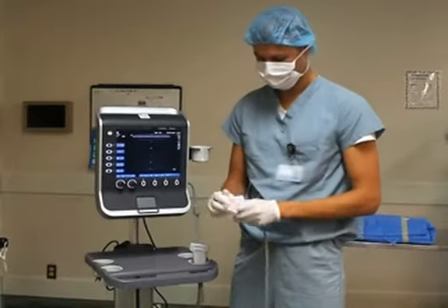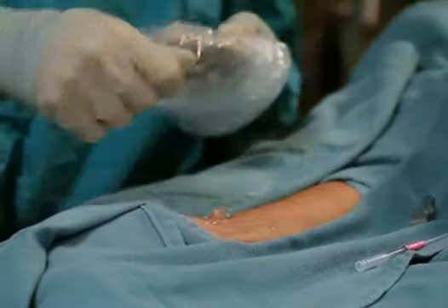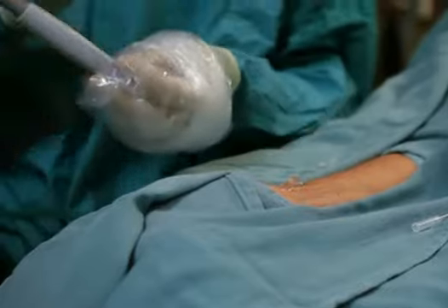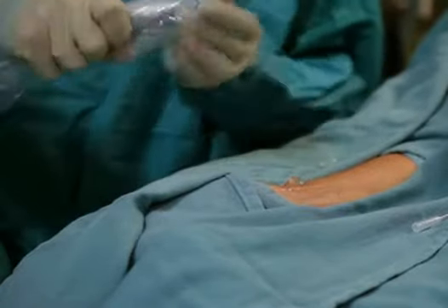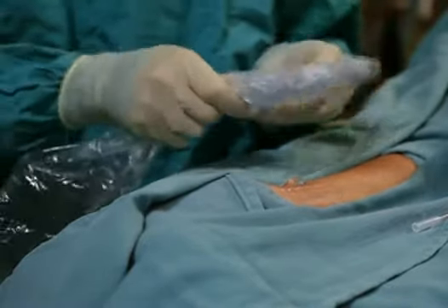Have an assistant clean the ultrasound transducer with an antiseptic wipe. Apply sterile gel to the inside of the sterile sheath and cover the ultrasound probe without contaminating the sterile gloves or the sheath. Remove any air pockets from around the probe, which if present will cause poor quality ultrasound images.